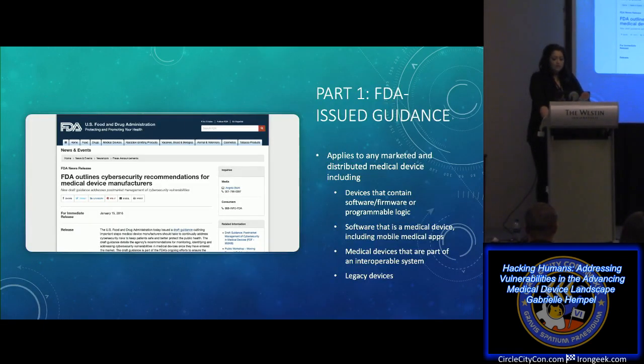So part 1, let's talk about the FDA-issued guidance. The agency developed this guidance as a result of an executive order that was aimed at strengthening national security, economic stability, and public health and safety.